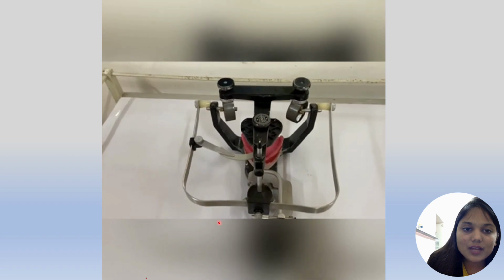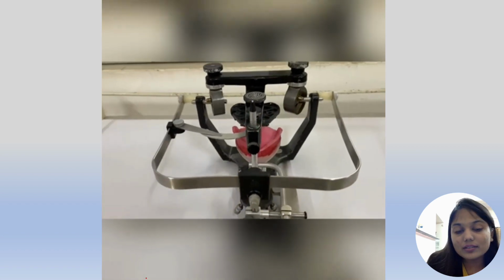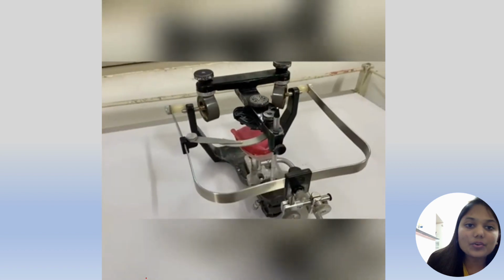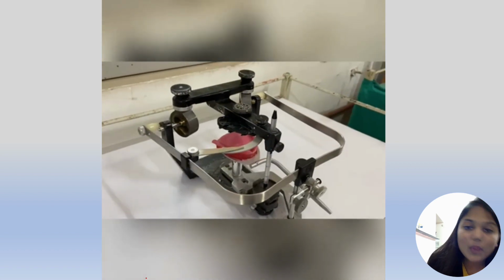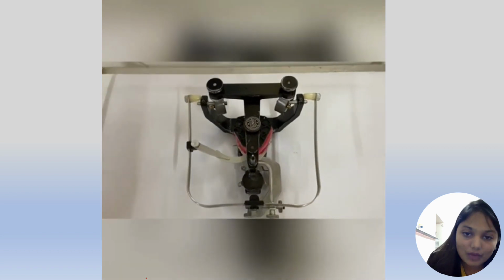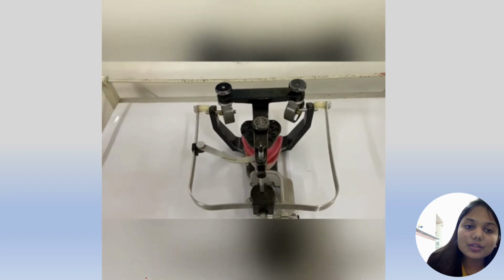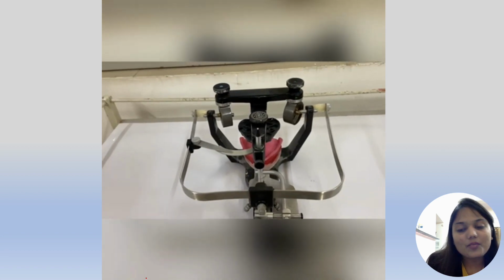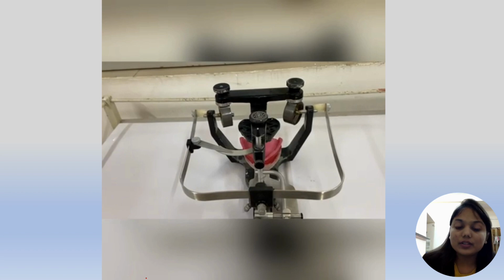And once that is done, we'll check that all the points are correct, and after that we'll go for mounting. In this video the mounting has not been covered, but this is the complete video of facebow record and transfer. So for the facebow record, anterior and posterior reference points are very important. So this was the video. Now by this video I have completed what the facebow record is and its transfer.